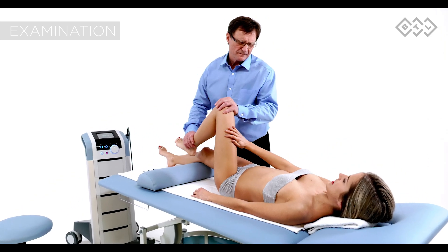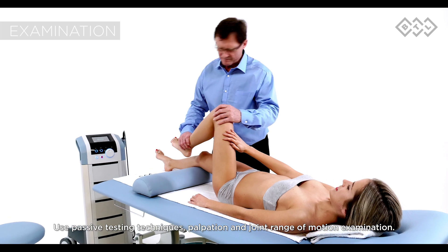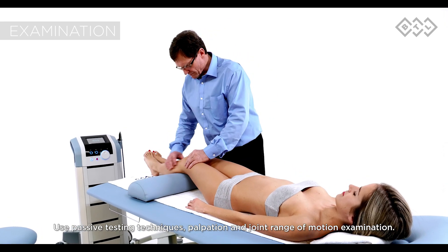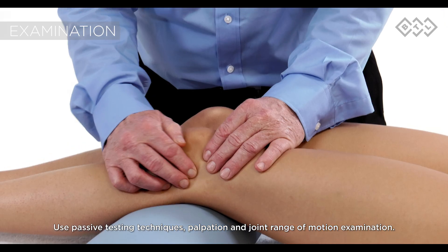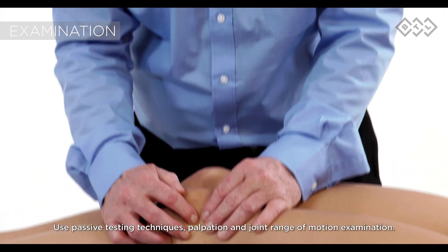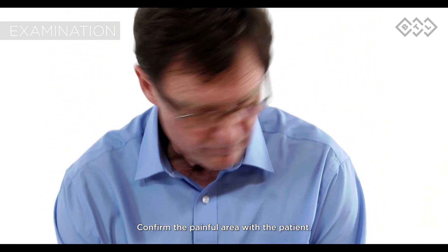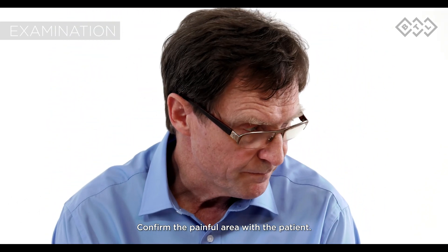Use passive testing techniques, palpation, and joint range of motion examination. Confirm the painful area with the patient.